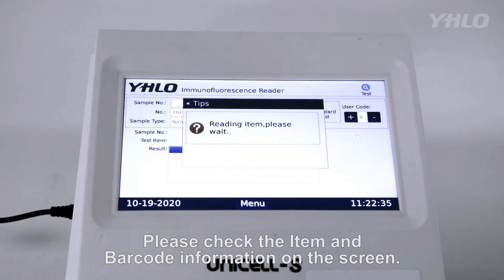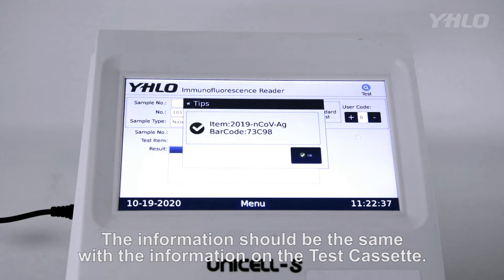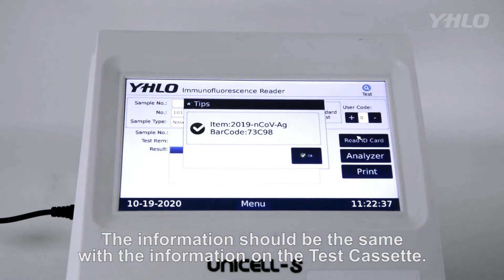Please check the item and barcode information on the screen. The information should be the same as the information on the test cassette.